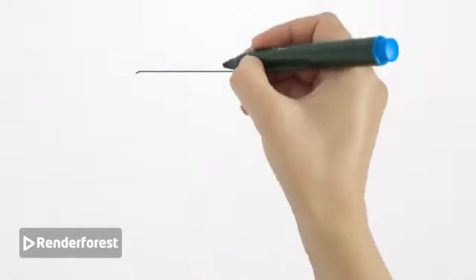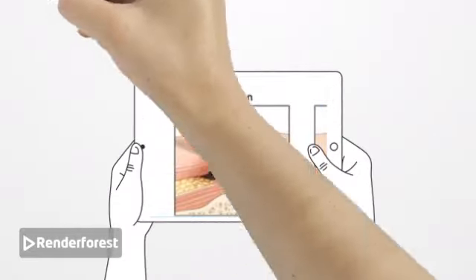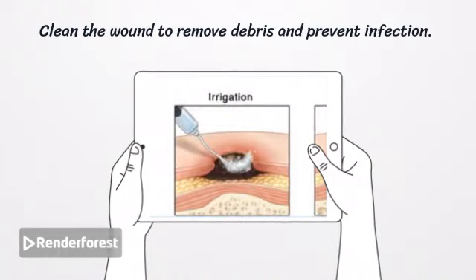Wound cleaning with sterile saline solution is essential to prevent infection. All dirt, debris, and contaminants must be carefully removed.